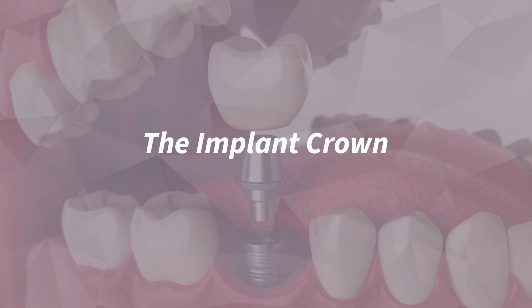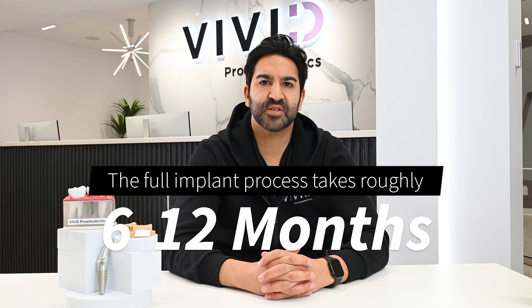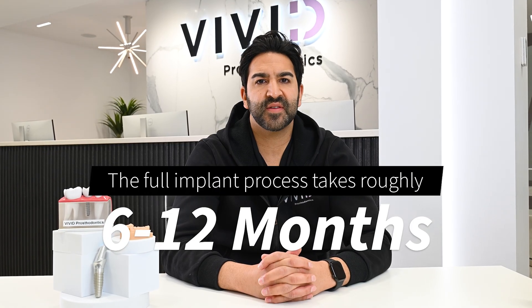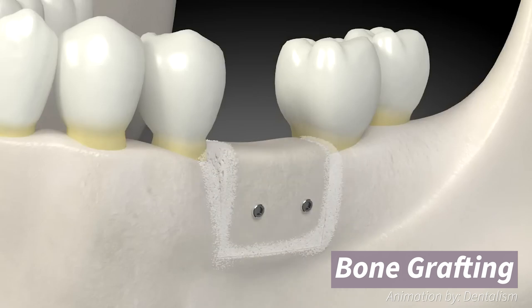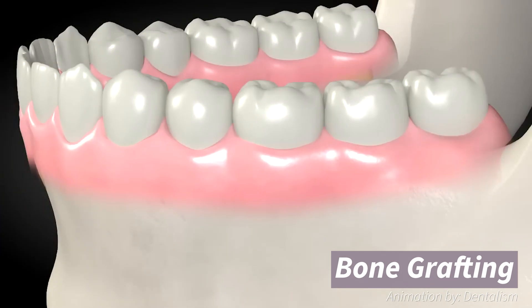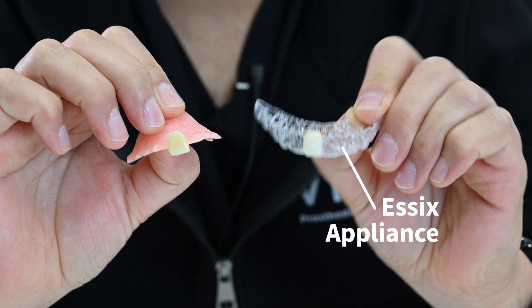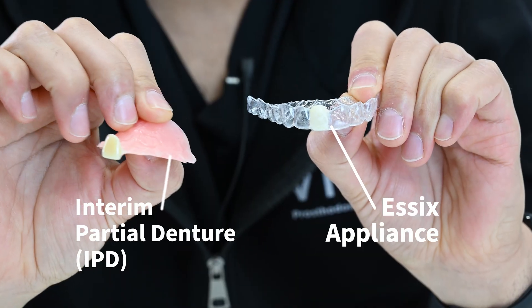The implant crown timeline. The full implant process takes roughly 6 to 12 months. The majority of this time is spent healing from the tooth extraction and the placement of the dental implant. Bone grafting may be required at the time of extraction to provide the best future implant site. During the entire process, an interim removable appliance will be provided to replace the missing tooth — either an Essex appliance or an interim partial denture.